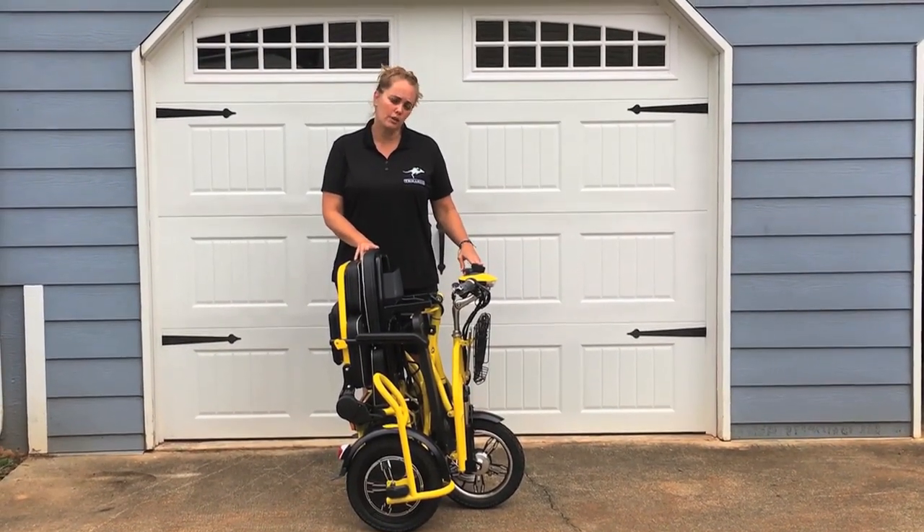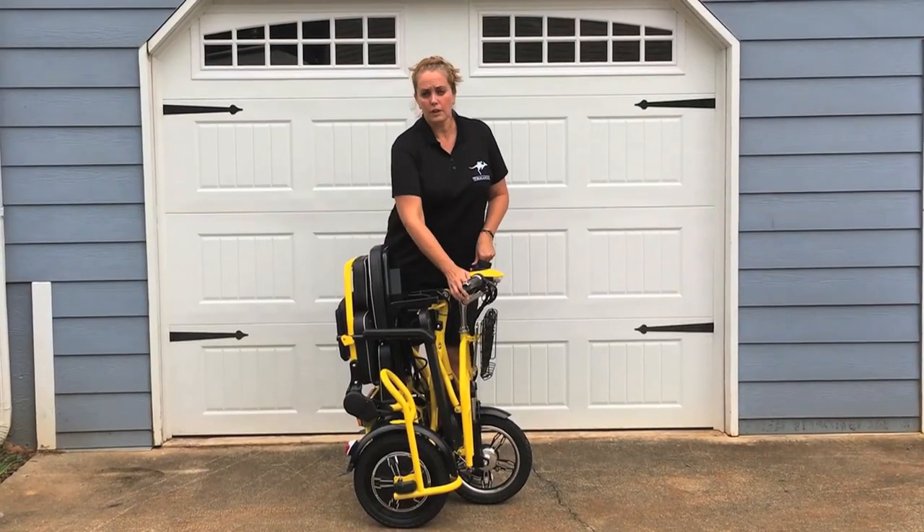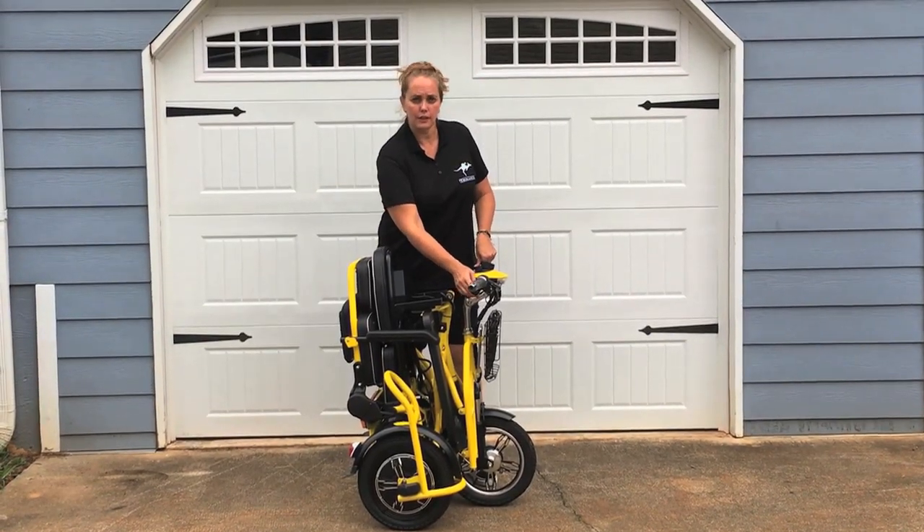You've got your USB charging port, turn signals, horn, forward and reverse, and three different gears.